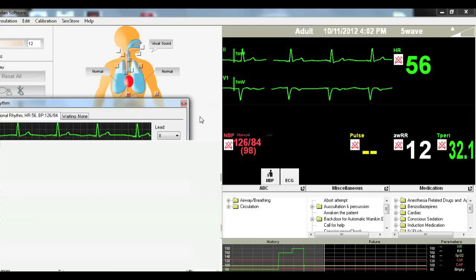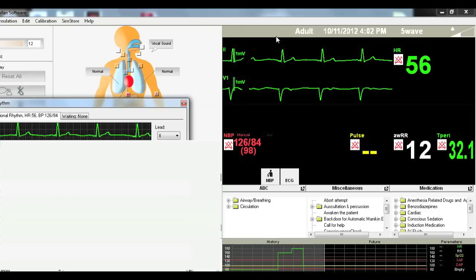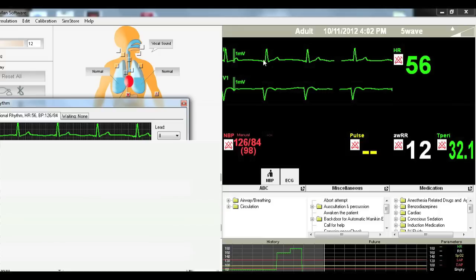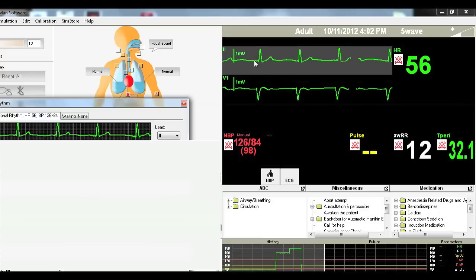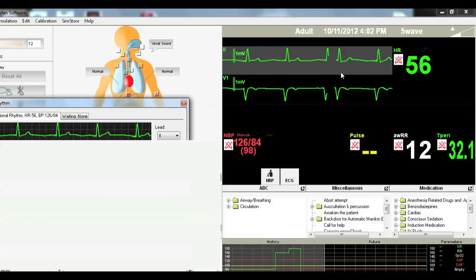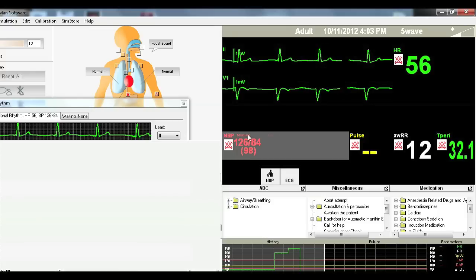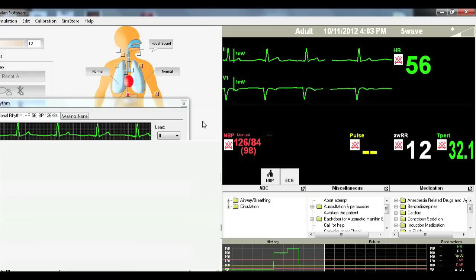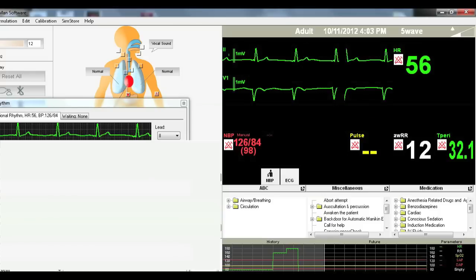So this is a junctional rhythm. So this is where the pacemaker of the heart is actually coming from the AV node and not from the SA node. So this is indicated by you don't have a P wave. If you do have a P wave, it's inverted. And you have a very slow heart rate. So I think in the other video we said you can have anywhere from 40 to 60. This is your typical pacemaker rhythm set by the AV node.